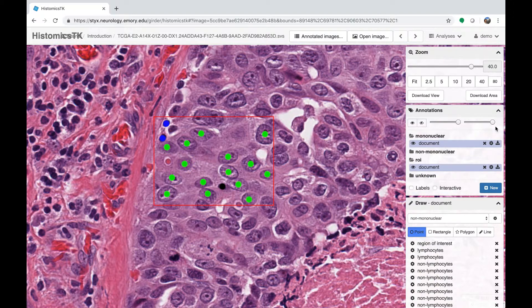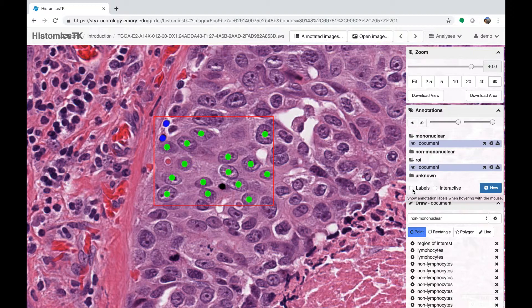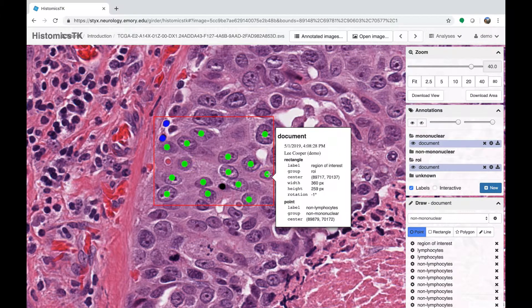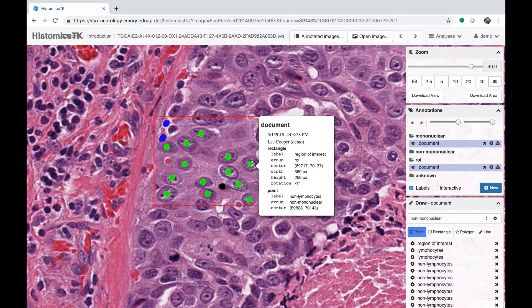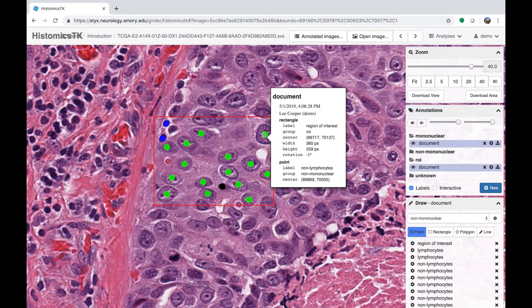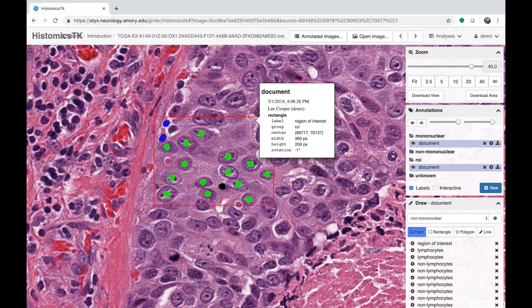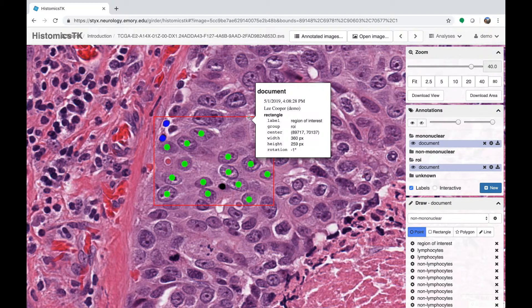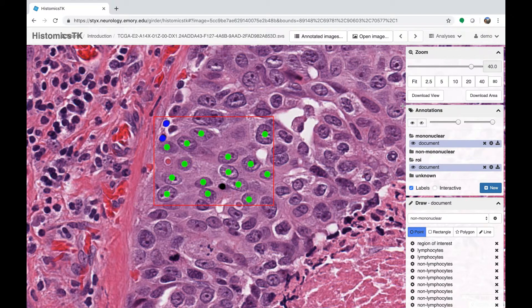In the annotation panel, there are sliders to control the transparency of all annotations globally — you can control the transparency of just the fill or the overall transparency. We often use the fill transparency when annotating large regions so we can see the outline but also see through the interior. There are also tools to view detailed information about annotations: click the labels checkbox and hover over annotations in the viewport to see information about the style, coordinates, and creation date. This is helpful during review. More detailed provenance information is stored in the database and can be accessed programmatically via the API.